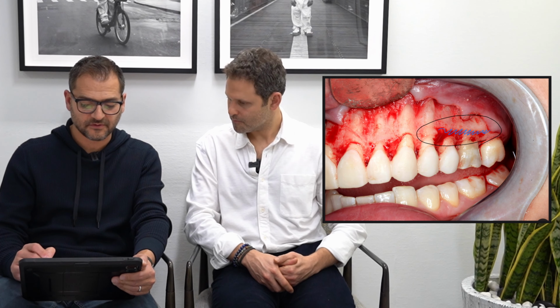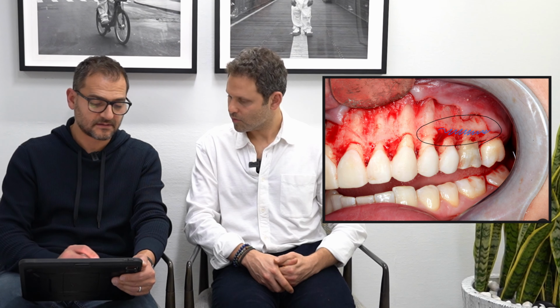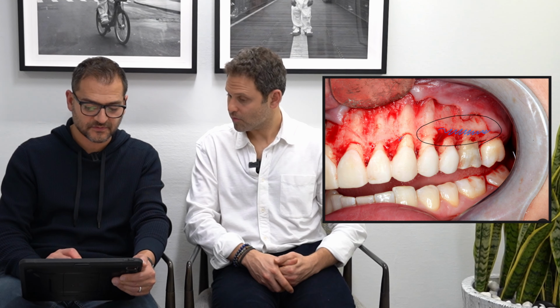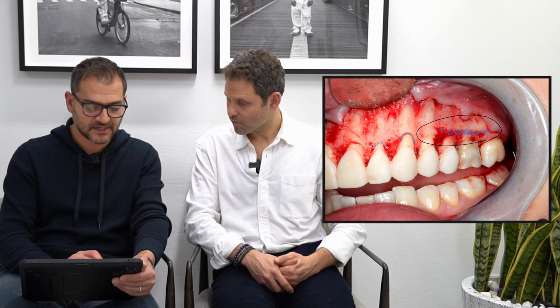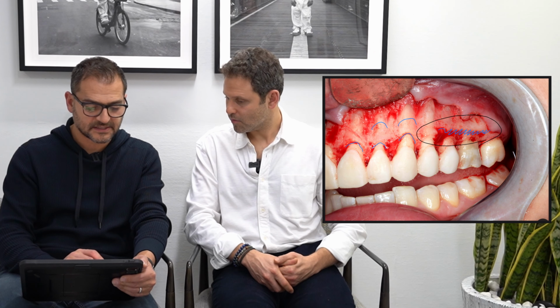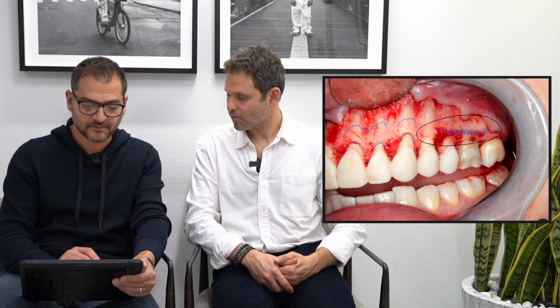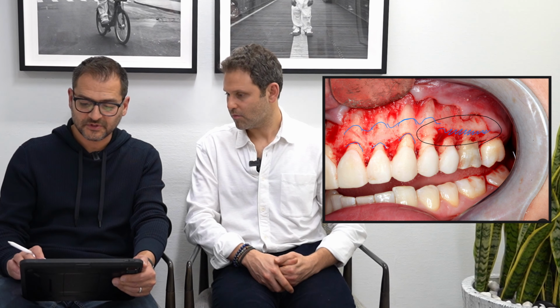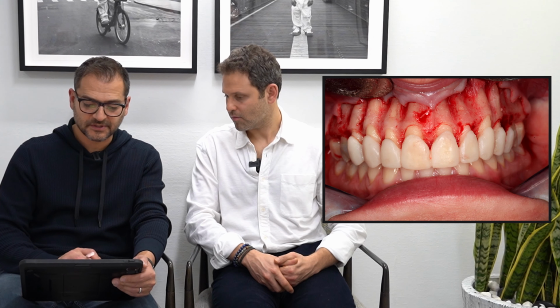and that allows me to get really fine detailing into the bone. It's important to recognize that the bone needs to be worked on just like the teeth do to get a good result, and it can take a long time, up to an hour, of just sitting there and really just polishing these edges, making things look really smooth, getting things to look, like I said earlier, parabolic and up and down, and just developing these natural root prominences. Once you've done that and you've laid your tissue back over it, you get a much more natural appearance.